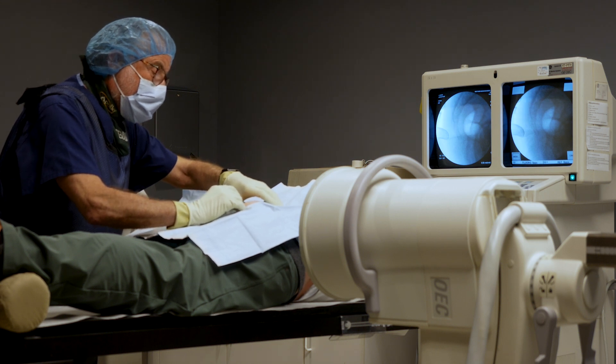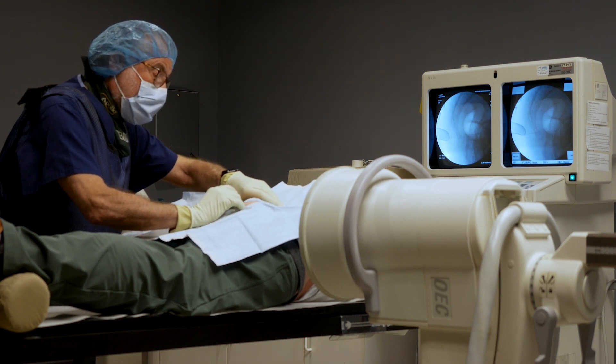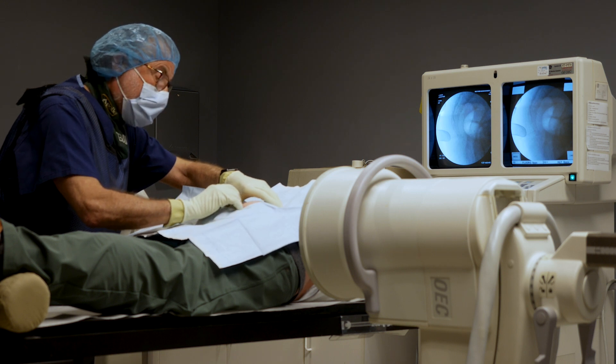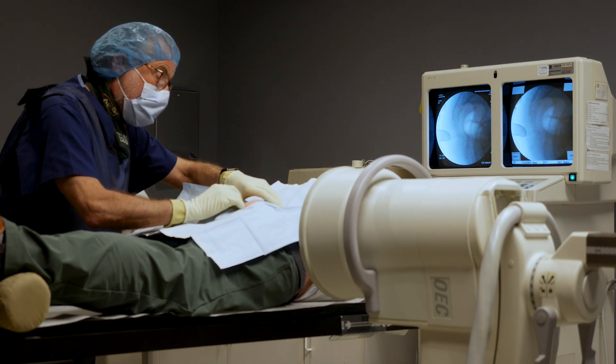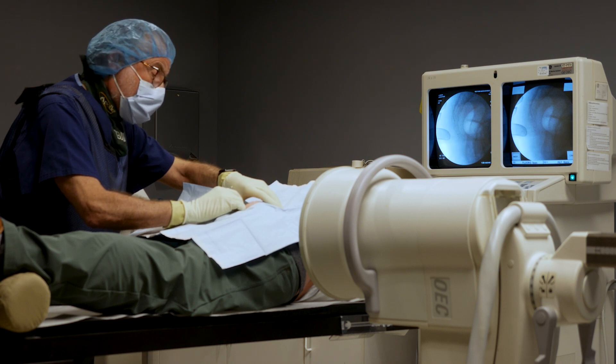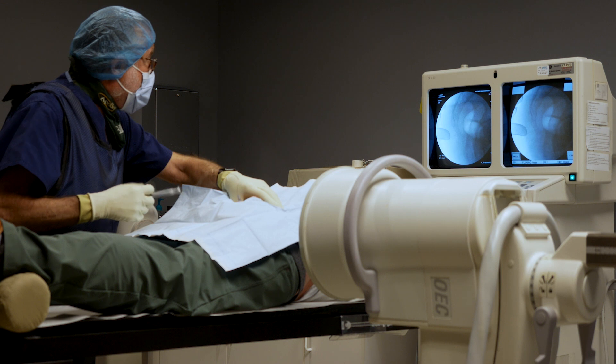You're not a wuss — this is not the most comfortable procedure. Almost there. That is right where I've had a lot of pain.